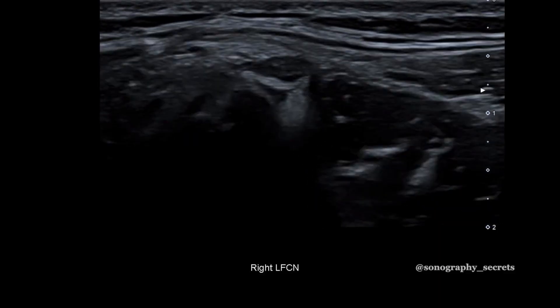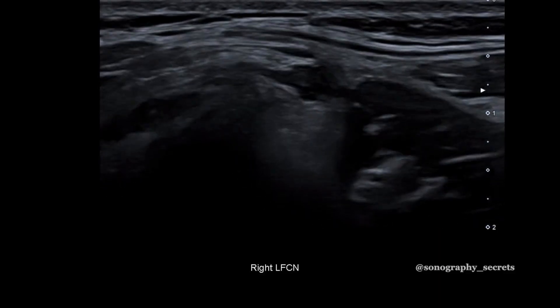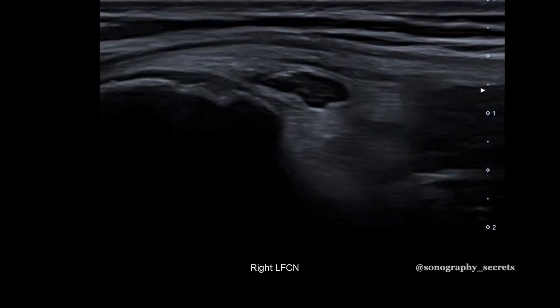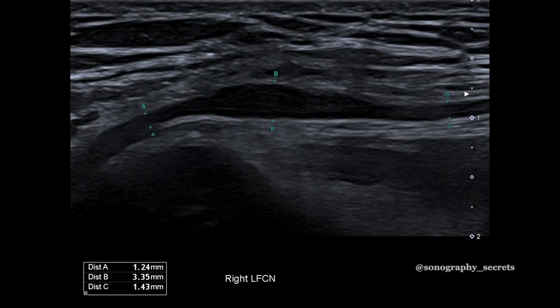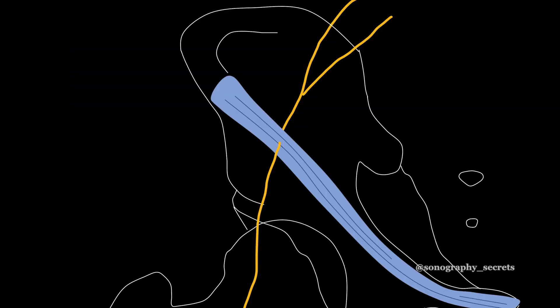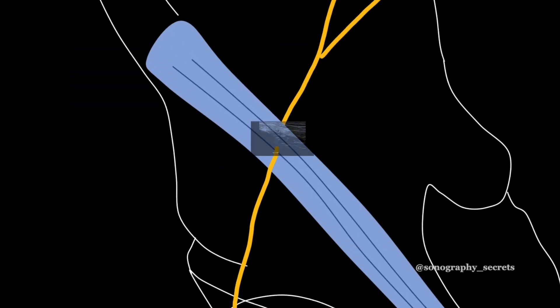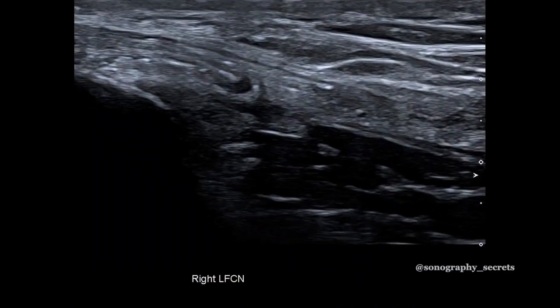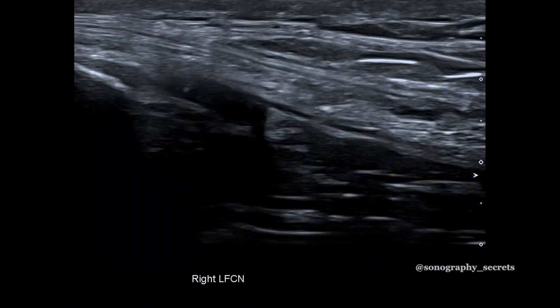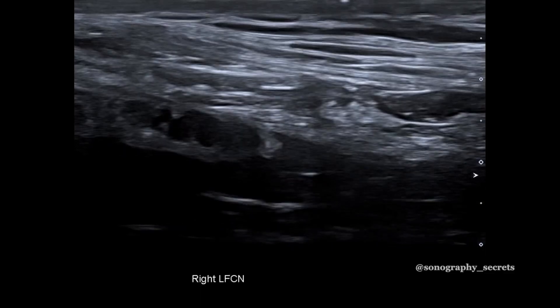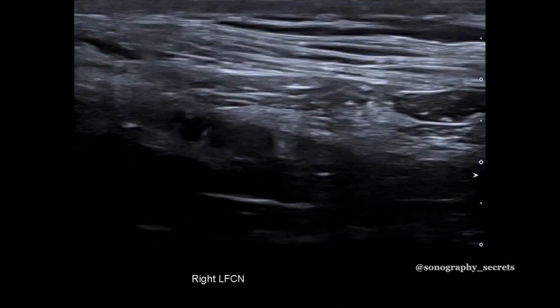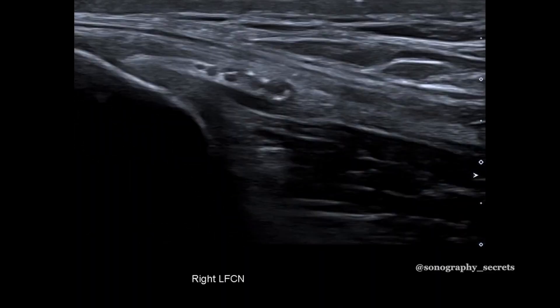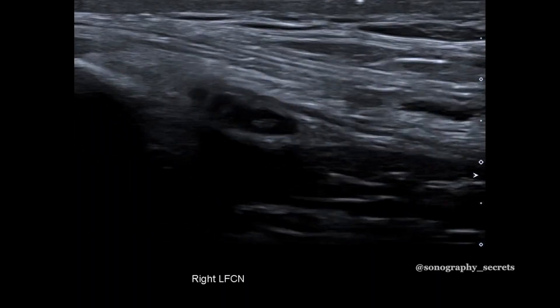We can see an abrupt calibre change and an increase in cross-sectional area, consistent with meralgia paresthetica. In this next example, the LFCN passes through the inguinal ligament. We have focal thickening of the nerve proximal to the site of compression, just like we see in a carpal tunnel.